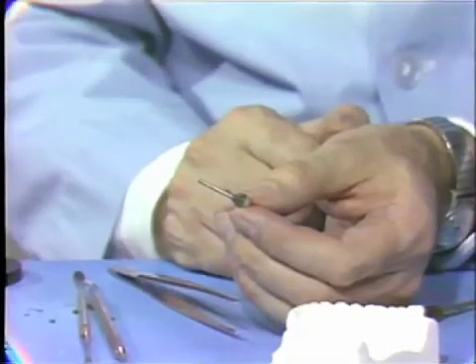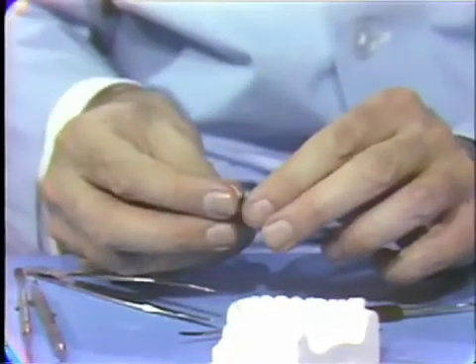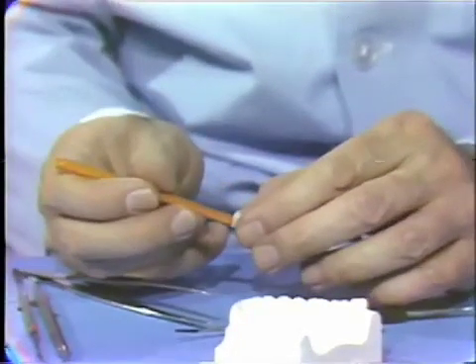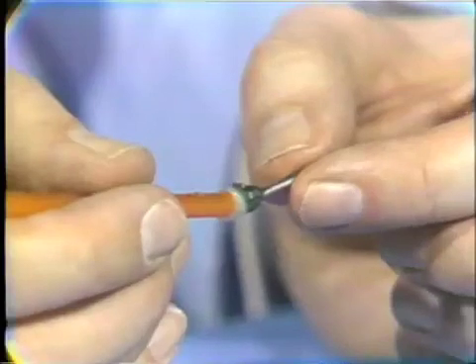Just allow the wax to harden. And then, in order to get a good grip on the porcelain, we'll take a stick of sticky wax, just soften the end. When the sticky wax is hardened, the facing is gently pulled forward off the backing.